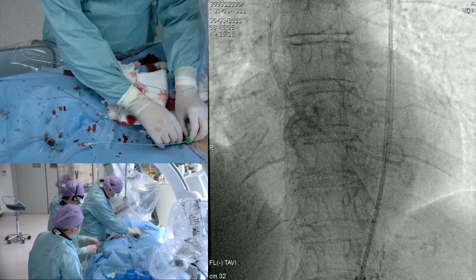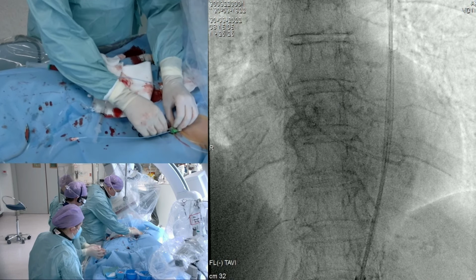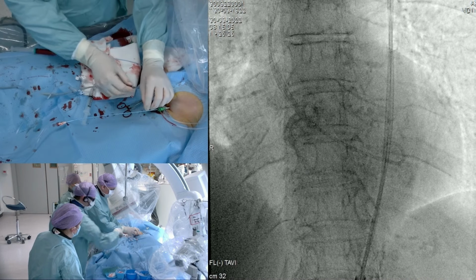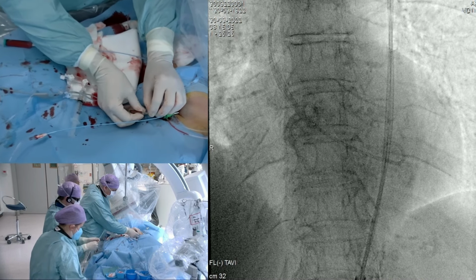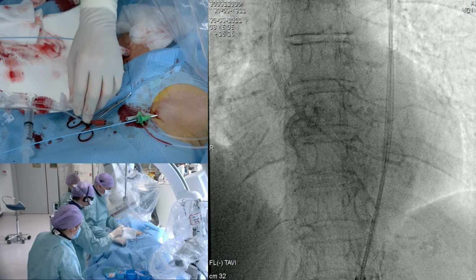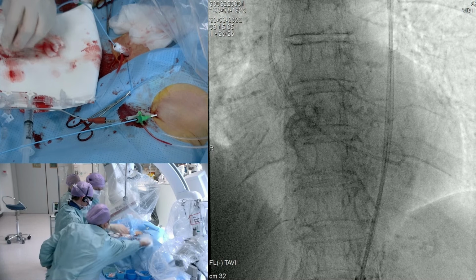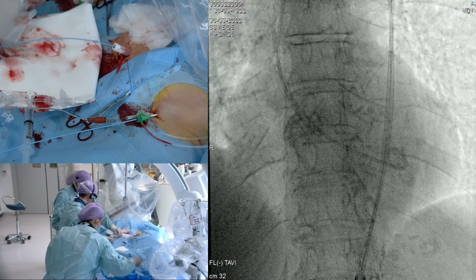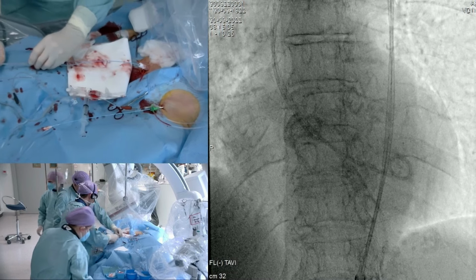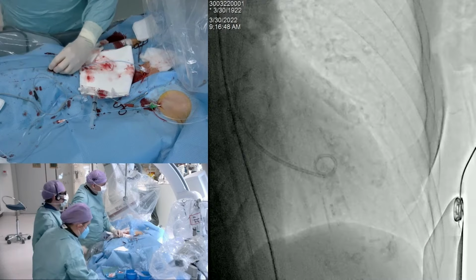So what we do is we have this 5 French venous sheath just as a backup if the patient would have complete AV block, and we're going to have a short guide wire introduced into that sheath here, and we're going to connect the pace electrode to that short guide wire, and I think it's going to give you better contact, higher efficiency of your pacing, and also your patient doesn't have these muscle contractions during pacing. So yeah, I think there are some advantages of using this technique instead of just a needle in the skin. So this is now the extra small Safari guide wire. Yeah, all fits with the smaller anatomy in this patient. Yeah. Okay.